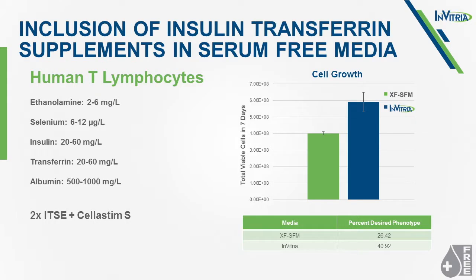Okay. So once a formulation is identified as being optimal, we will actually scale these formulations up into multi-passage tests that will confirm cell functionality as well as desired phenotype.